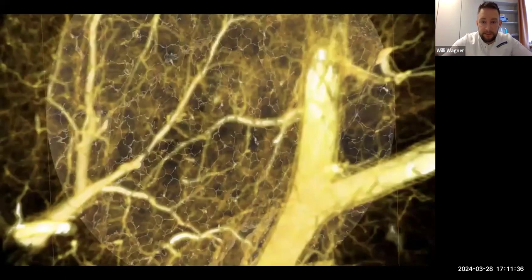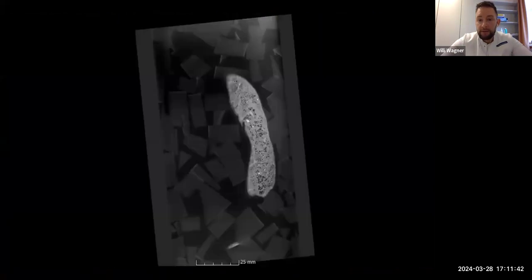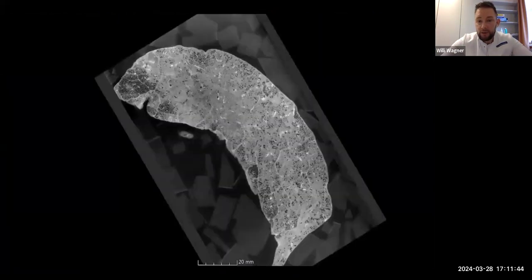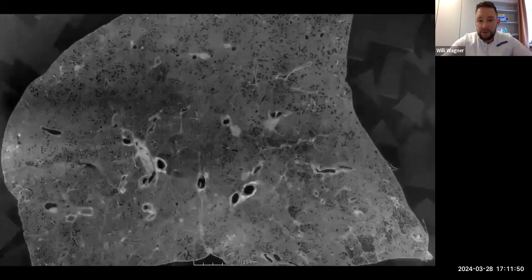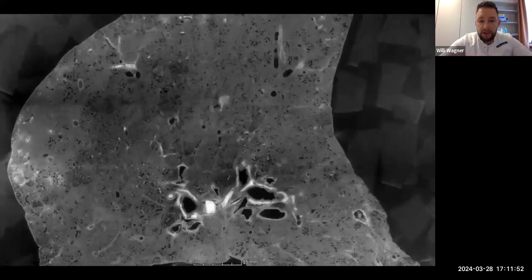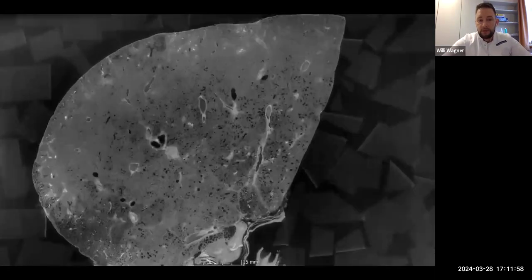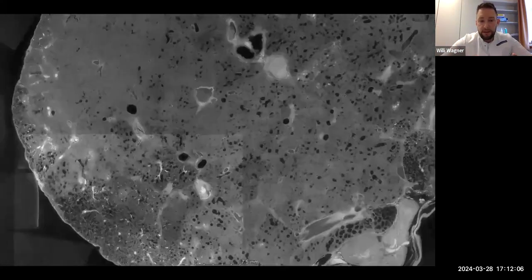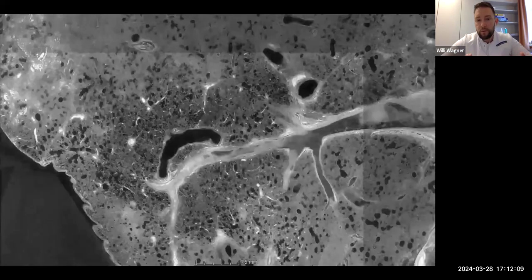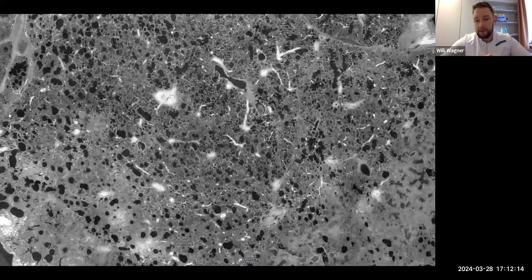That came in really handy in helping to understand what was killing the lung. Here we looked at a healthy lung from a donor. However, a diseased COVID-19 lung would look very different. So this is still what we see in clinical routine imaging. We see vast consolidation of the lung, but synchrotron imaging gave you the opportunity to zoom in to regions of interest at an unprecedented resolution while still knowing where in the entire organ you are.